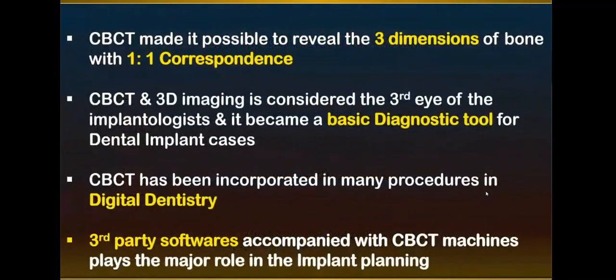First, the CBCT is the pioneer modality for implant cases because it gives the 3 dimensions in one-to-one correspondence. And the CBCT is actually considered like the third eye of the implantologist. For this reason, it became a basic diagnostic tool for implant cases.